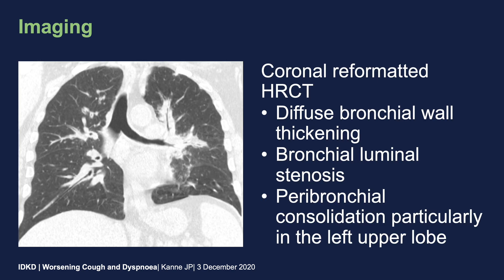He underwent chest CT for further evaluation. On this coronal reformatted image, we see diffuse bronchial wall thickening, bronchial luminal stenosis, and peribronchial consolidation, particularly in the left upper lobe. There's relative sparing of the imaged portions of the trachea and main bronchi.